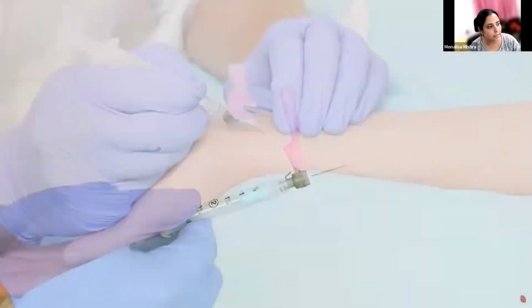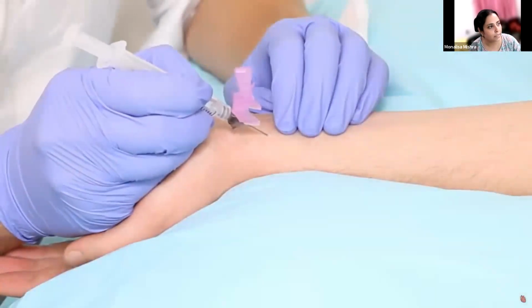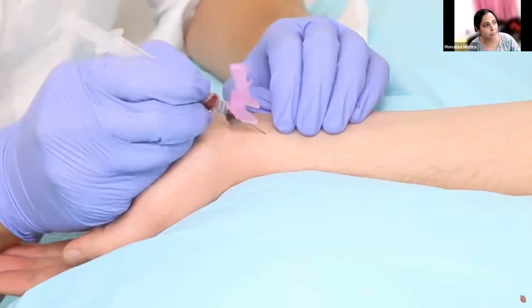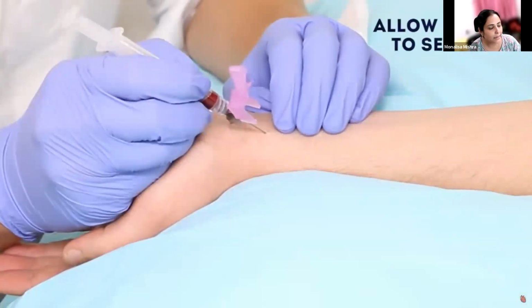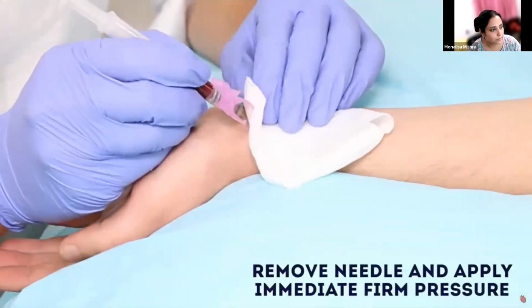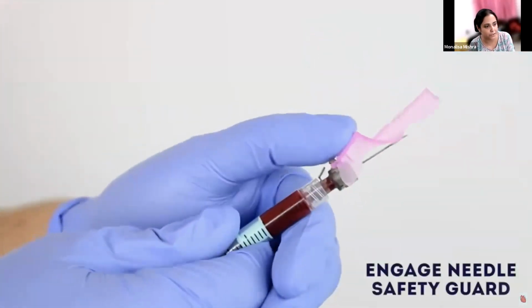This is a heparinized syringe. You insert the needle at 45 degrees. You observe the flashback of blood coming, which shows that it's an arterial sample. Once you get your sample, you remove the needle and then apply firm pressure.